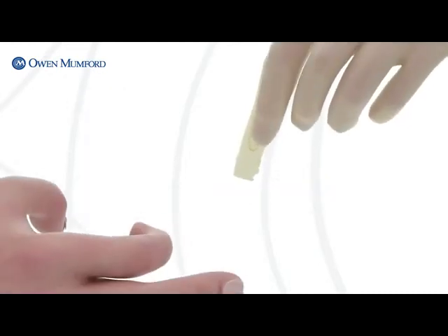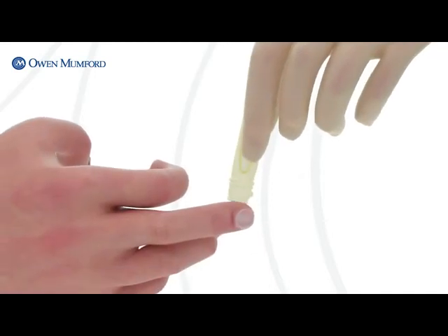Gently press the lancet against the sample site and activate the trigger. No additional pressure required.